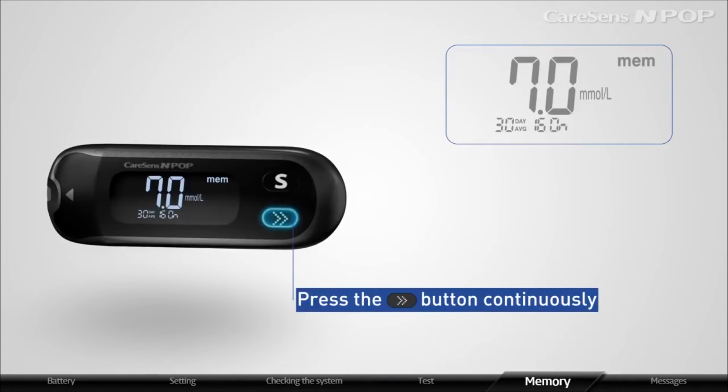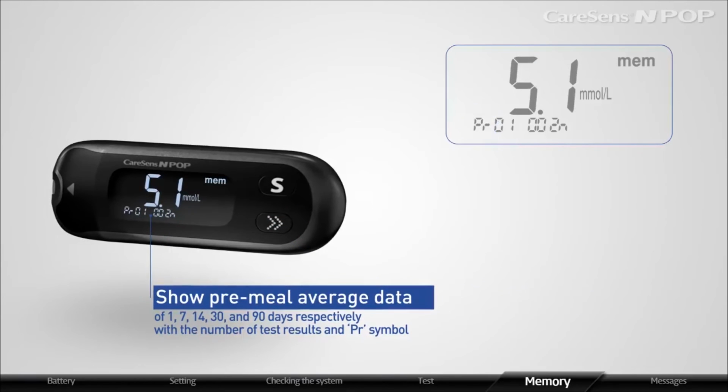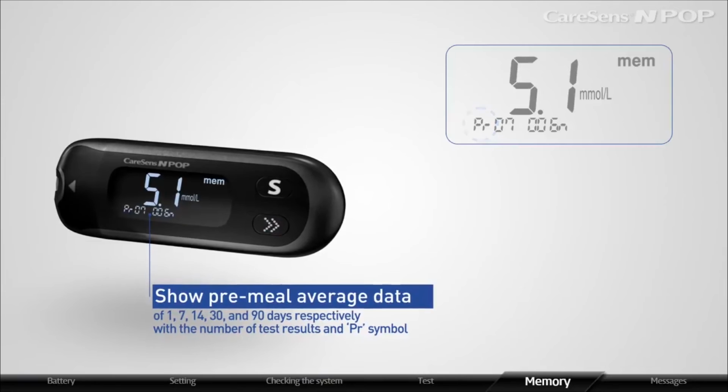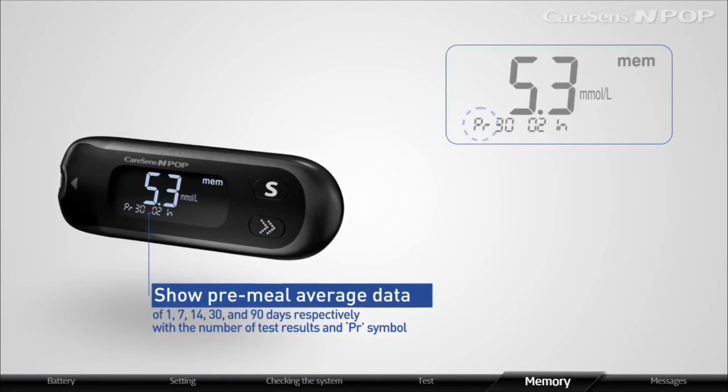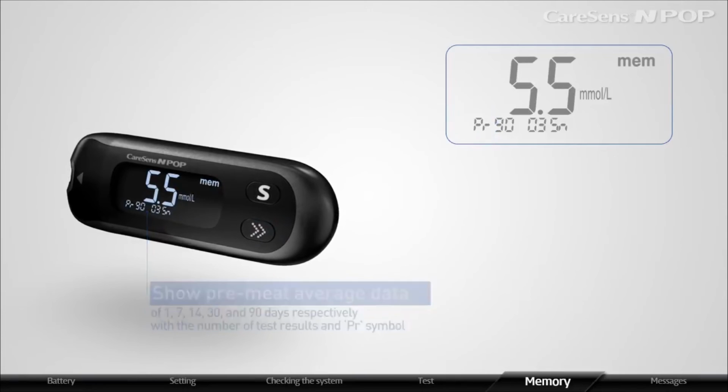Press the arrow button continuously for the meter to show pre-meal average data of 1, 7, 14, 30, and 90 days respectively, with a number of test results and PR symbol.